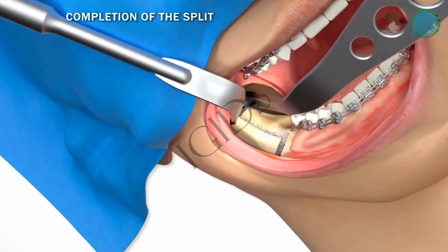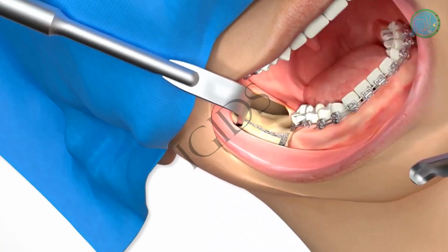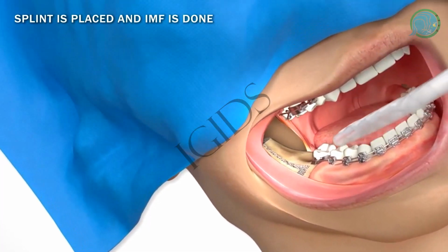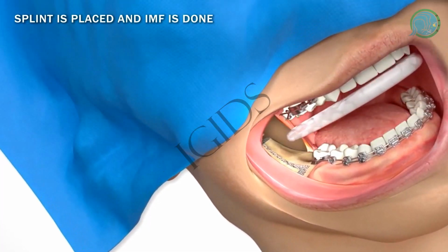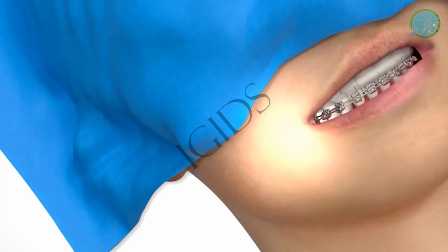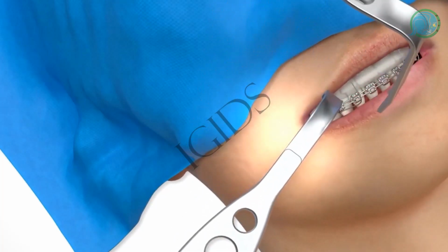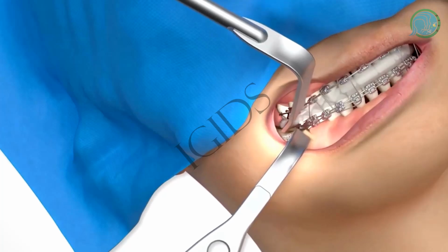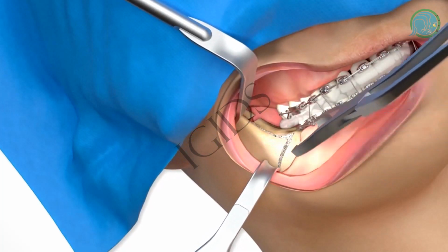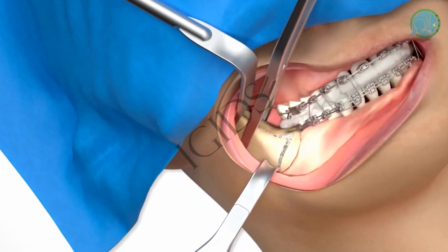The split is completed by slightly pulling the distal tooth-bearing portion of the mandible forward. After osteotomy, a prefabricated interocclusal acrylic wafer splint is placed. We achieve maxillomandibular fixation with 3 ligature wires.